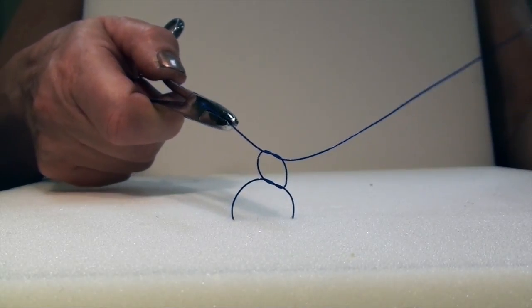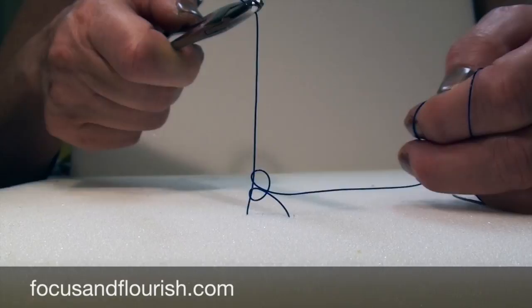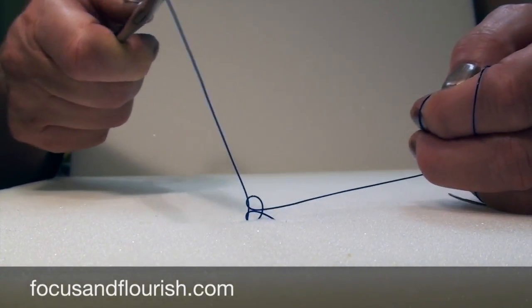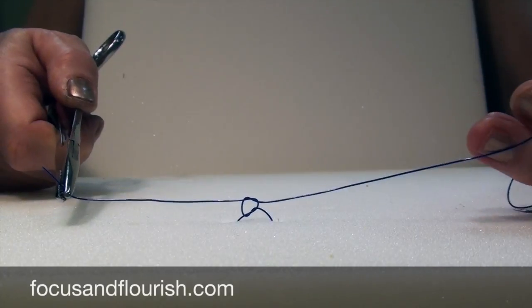For a square knot, that short end is brought back to its original position. But to slip it, you're going to pull up on the short end. And then square it off to lock the knot back in place.